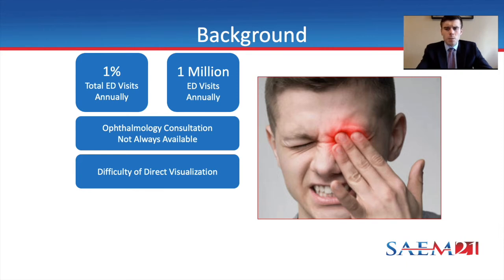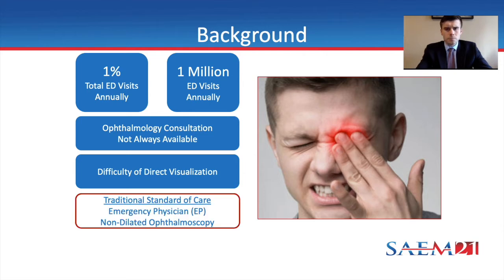As such, evaluation of posterior ocular abnormalities remains a challenge in the emergency department, and variable practitioner experience and comfort in performing fundoscopy complicates this picture. Prior to the introduction of point-of-care ultrasound, EP-performed non-dilated ophthalmoscopic examination was considered standard of care.